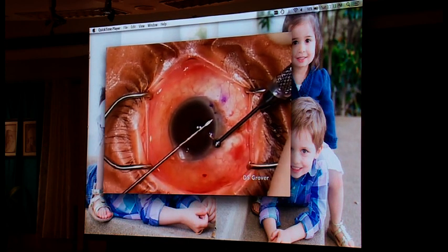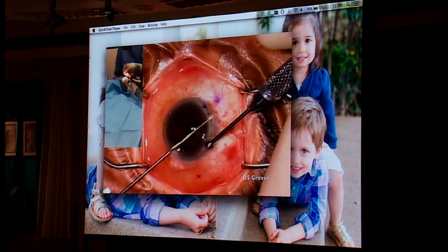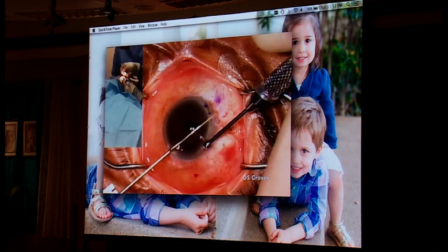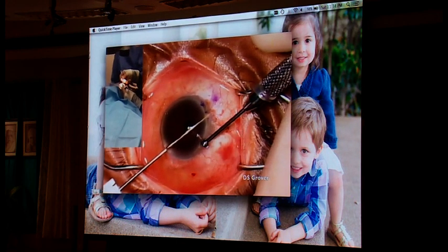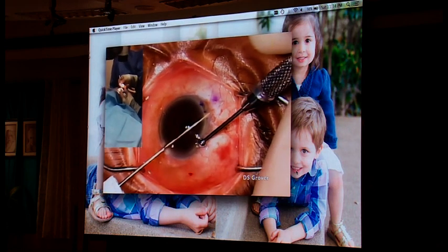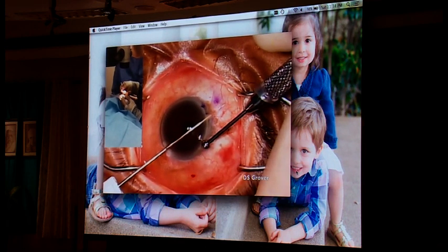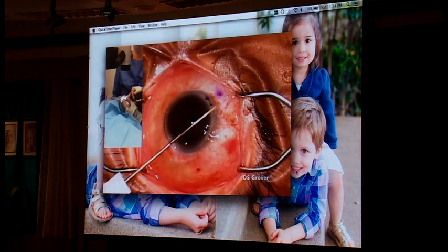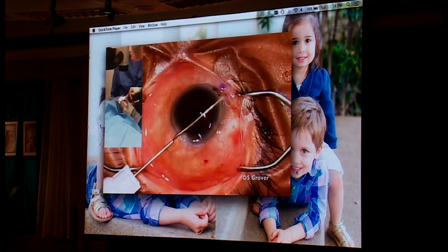But the key thing is what's going on in this top left window that I'm going to put in. As you're injecting it, watch what my hands are doing in that top left window. You want to gently go through and come out and tent up the conj just a little bit and come out in the subconjunctival space. I'm just shimming it, and you can see the needle coming out right there. Then you're going to see my thumb slide the injector anterior. Halfway through the slide, you're going to see the implant be deployed, and the other half is when the needle retracts. So I've come out of the eye, I let it come back into its normal position, and then I continue with the sliding mechanism, which retracts the needle out of the eye.